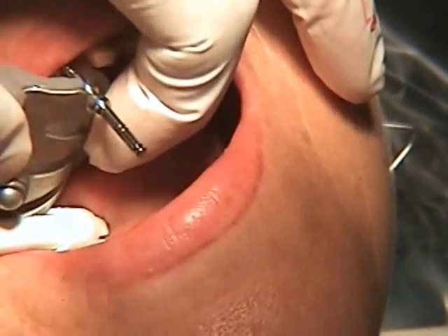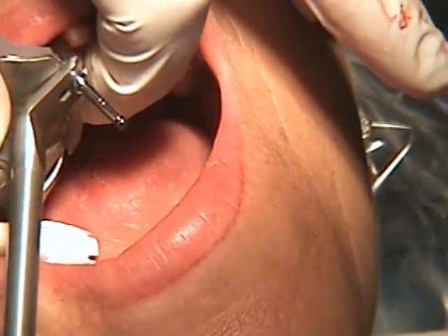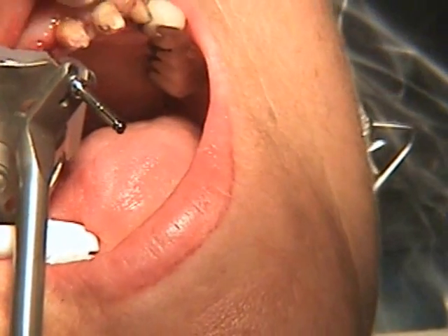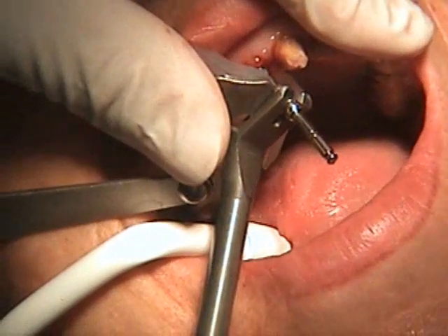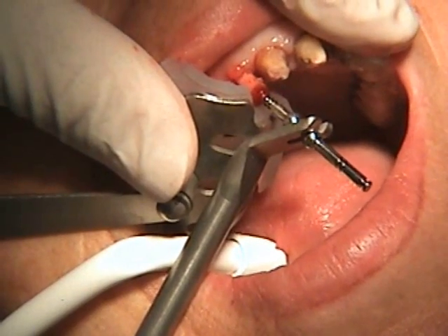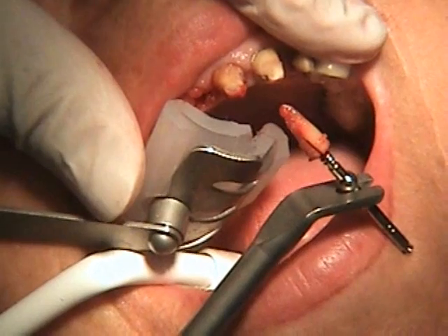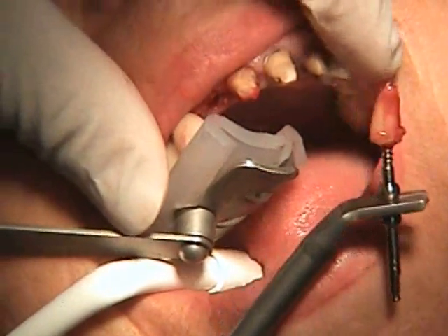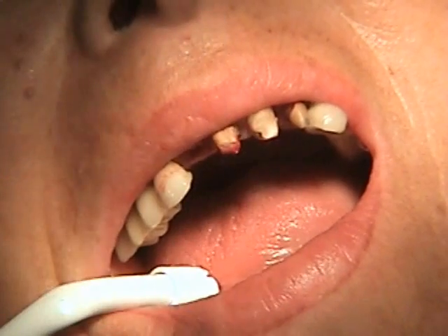This is a special metal with a silicone to protect the other roots. And this looks like a pry bar. With just a little bit of force, we're then able to pull the tooth right out of the socket. Out it goes — I'm just going to remove it slowly so you can see it. With minimal effort and no trauma to the bone and no trauma to the tissue, we're ready to go.